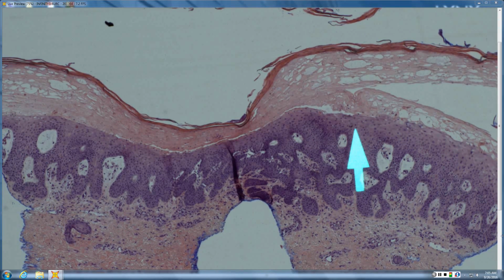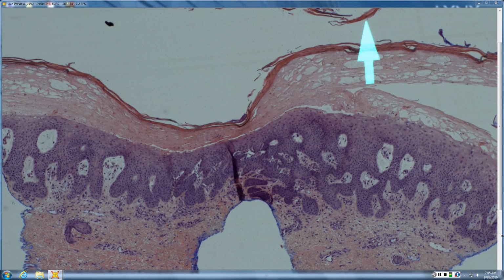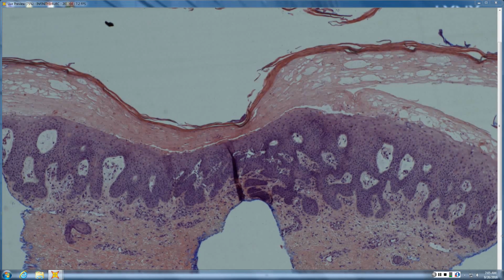So typically, particularly for something like EM or fixed drug or SJS-TEN, we like to say full thickness necrosis and death and squalor that's way out of proportion to an otherwise acute basket weave stratum corneum, which you do not see here. This is subacute and more chronic changes to the epidermis and not that acute basket weave. And then you also don't see really any infiltrate down here. You don't see any pigment dropout, although you might. You wouldn't see eosinophils if we went looking, hopefully not. So those things would help point you against those other things on the differential.